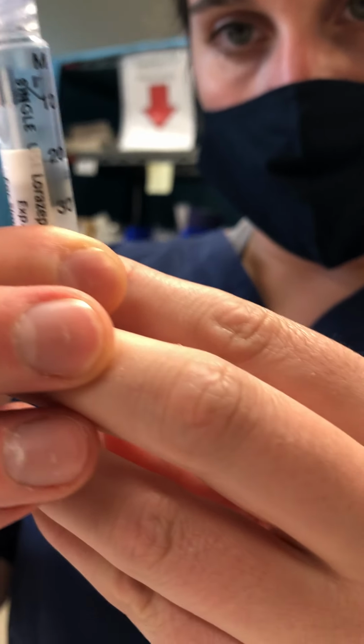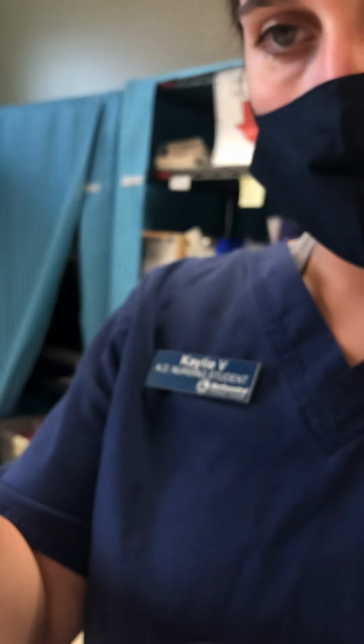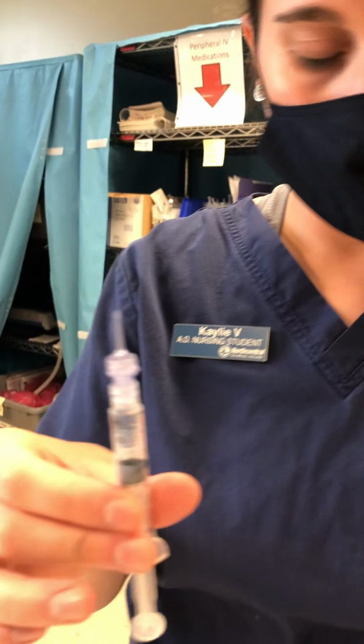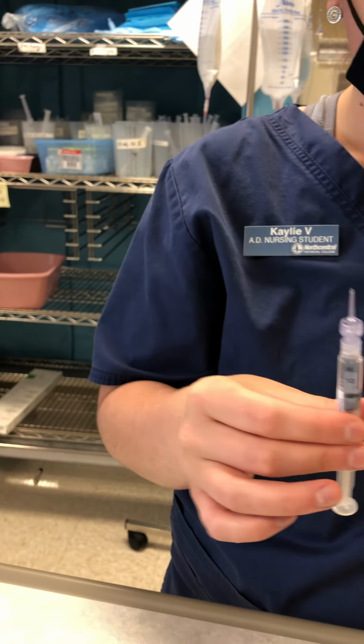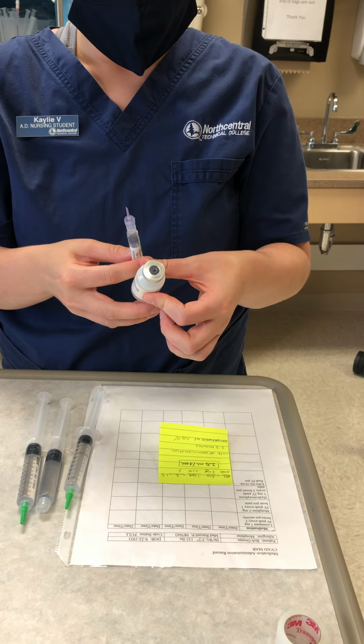You're going to do the whole 10, so you can pulse, or you can just put the 5 in, and then you can pulse the last 5. Alright. Okay. I'm taking my medication and my MAR. 5 with the peripheral, 10.